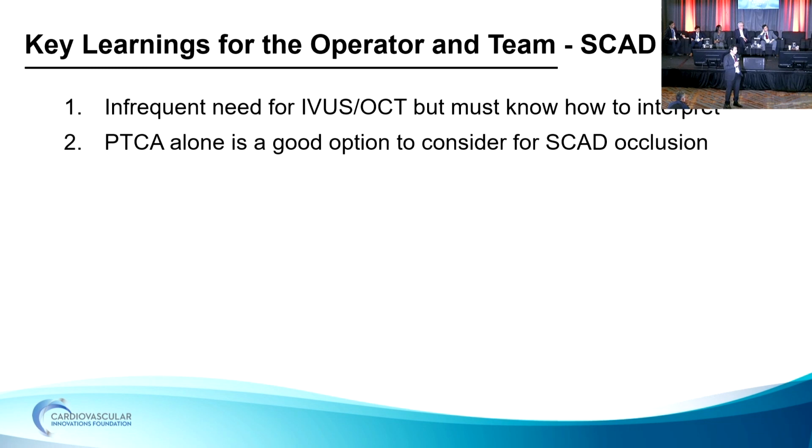So maybe ballooning is enough, but what has been published is also the cutting balloon. I know you may be lucky and just a balloon may do it. But if it doesn't, what's your next step? That's the question, right? If you still have TIMI 0 flow in the distal LAD, you've got to do something.